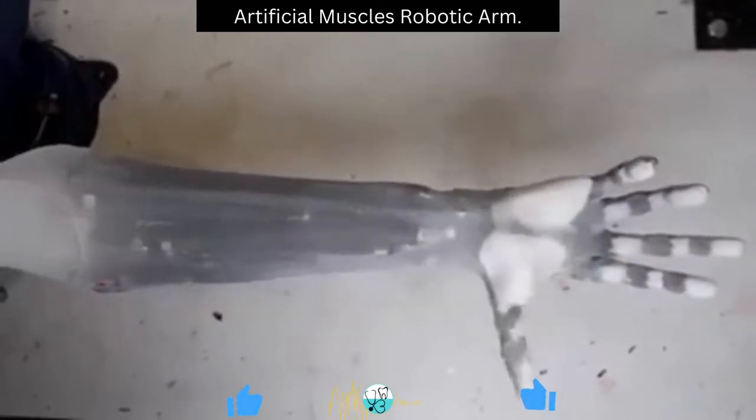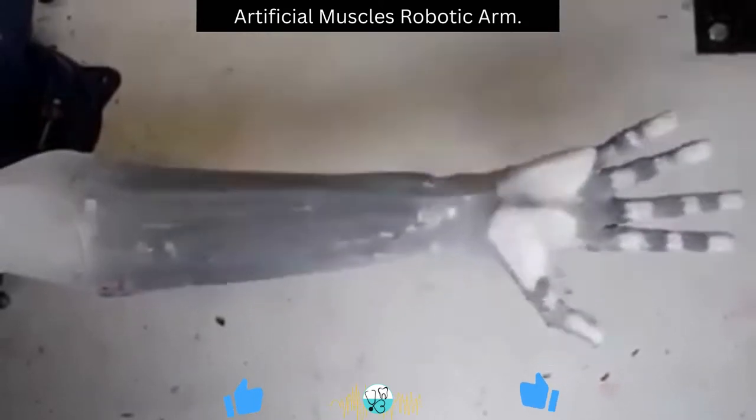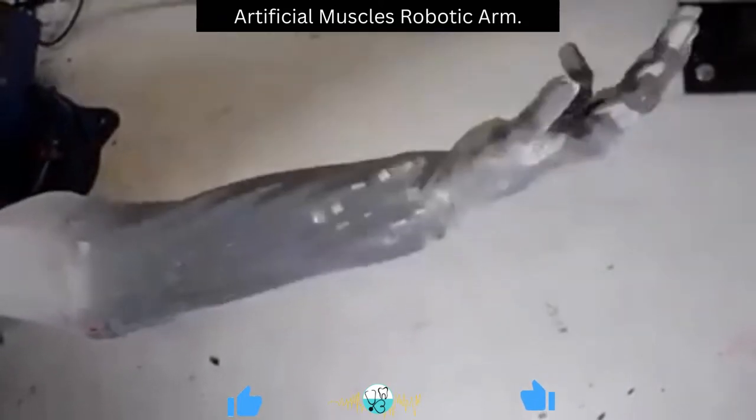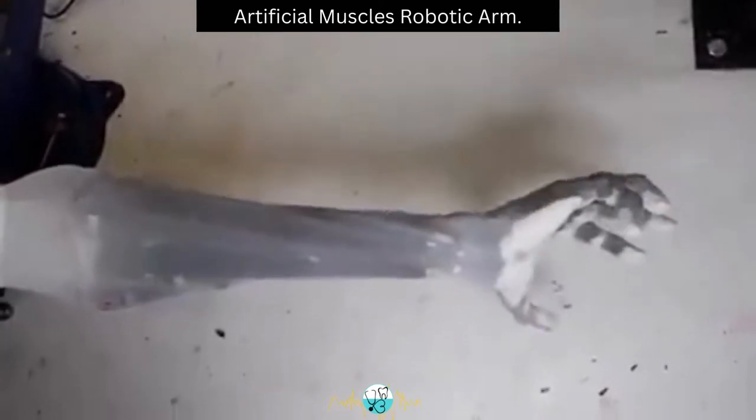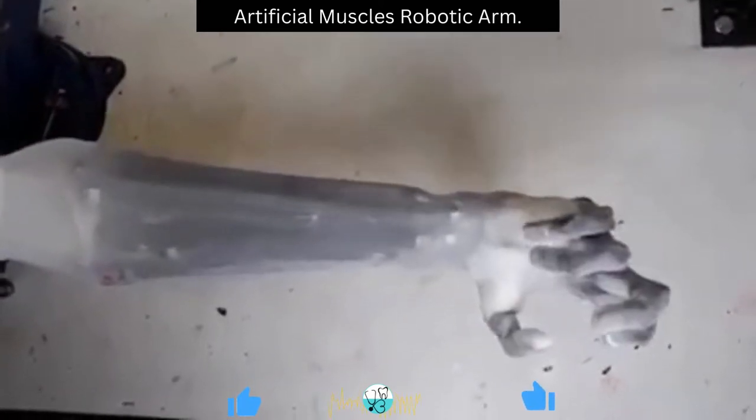Scientists have recently developed a new prosthesis which they call the artificial muscles robotic arm. It is operated by water and consumes 200 watts at peak. The hand weighs 1 kg and the dumbbell weighs 7 kg.